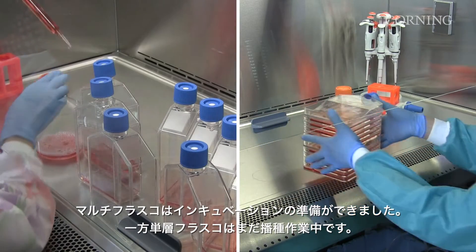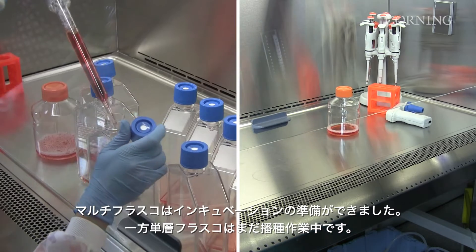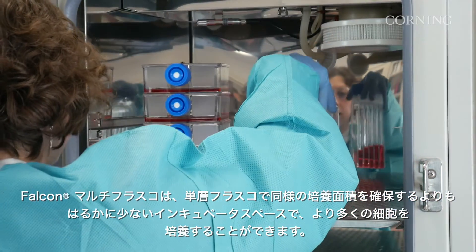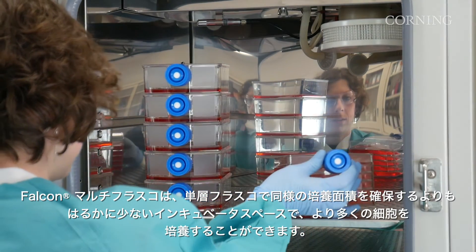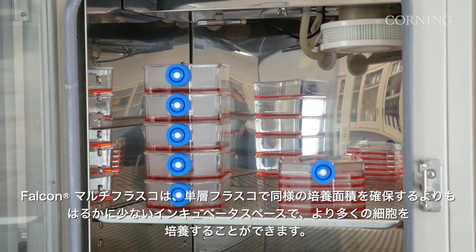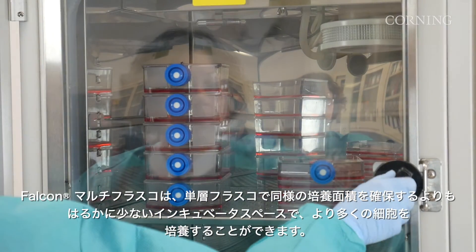The Multiflask is now ready for incubation, while the single-layer flasks are still being seeded. A Falcon Multiflask takes up far less incubator space than an equivalent number of single-layer flasks, which means you can incubate more cells in less space.